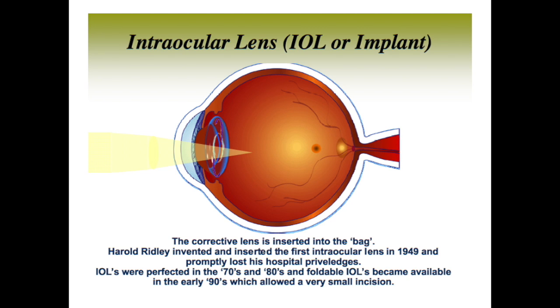And what he noticed was that this plastic that was lodged in the eye sometimes for weeks, unlike other foreign bodies inside the eye, there was no inflammatory response. It just lay there. And he said, "Wow, that's interesting. Maybe I could use this type of plastic and use it as an intraocular lens for cataract surgery."